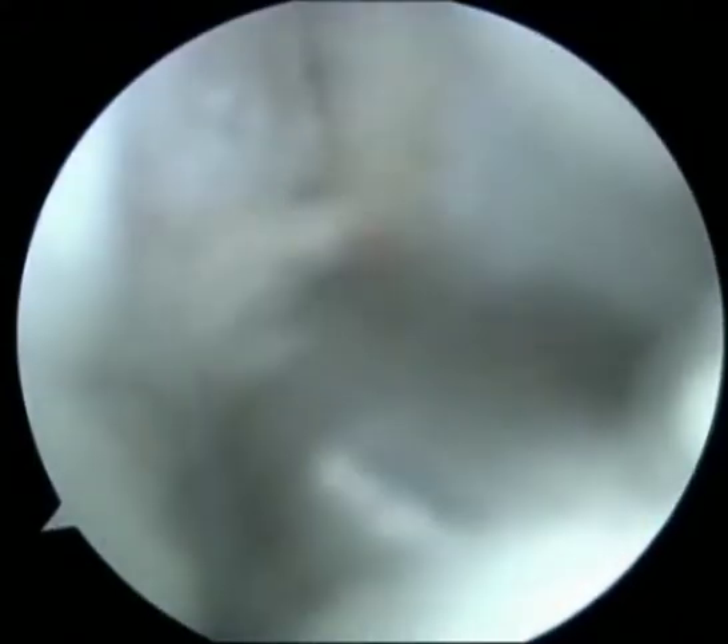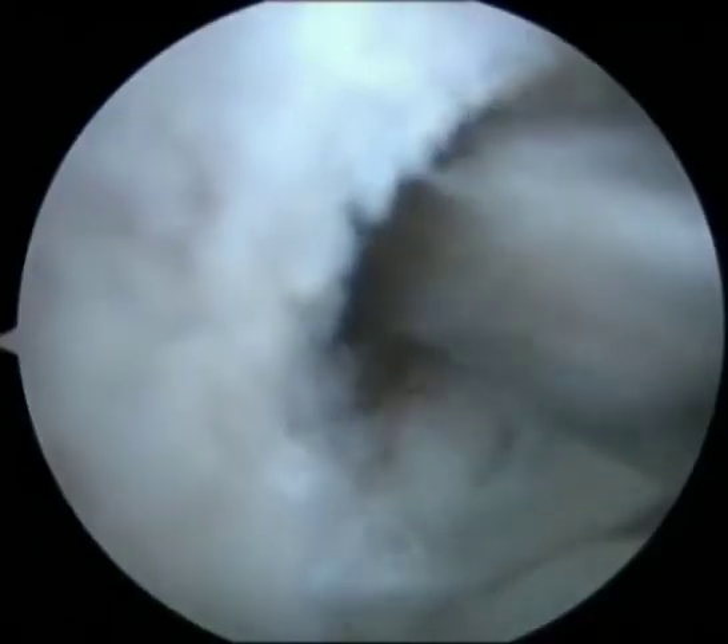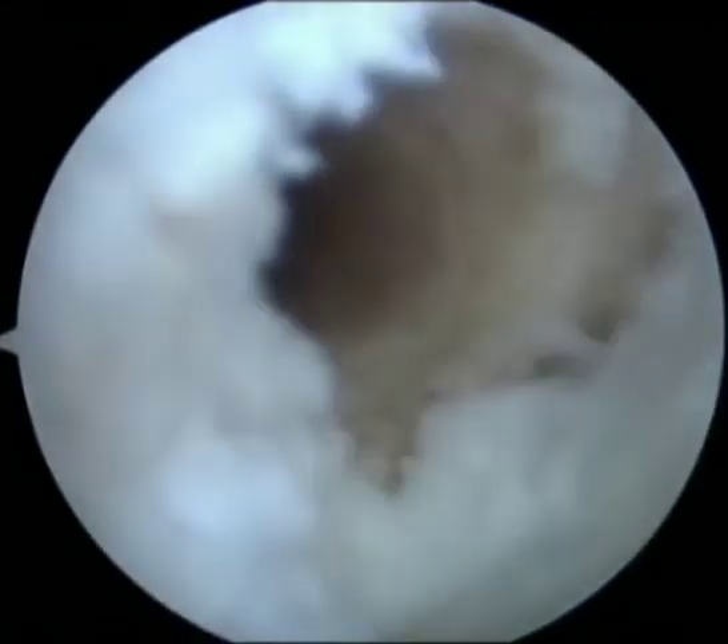The right knee is being operated upon. The knee are hip and in flexed position. A 30 degree arthroscope has been inserted to the anterolateral portal.